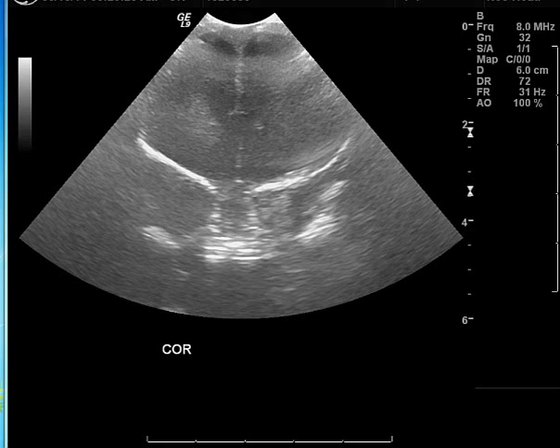We use a high-frequency transducer which is placed on the head of the neonate. This is mainly done via the anterior fontanelle, which is the largest fontanelle present at birth. We place the probe on top of the fontanelle and scan primarily in two planes: the coronal plane and the sagittal plane. I'll show you images of what you're supposed to see while doing the scan.